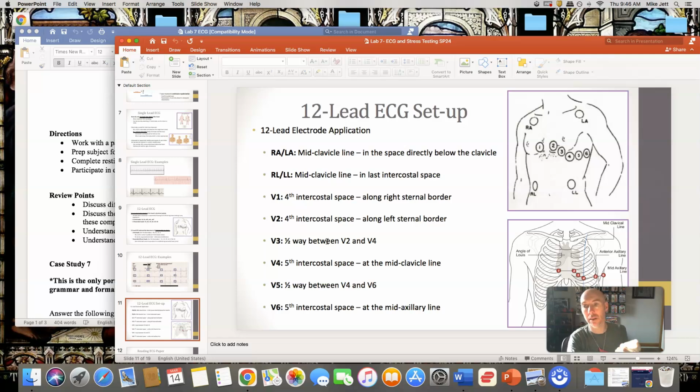For the quiz, we would probably be working with the stickers. So you would be palpating directly, over our clothing, in the appropriate location and placing stickers in the appropriate location. But again, you should be able to verbalize it, just as it says here, but then also palpate it as well. Okay, so spend some time reviewing this or practicing it.